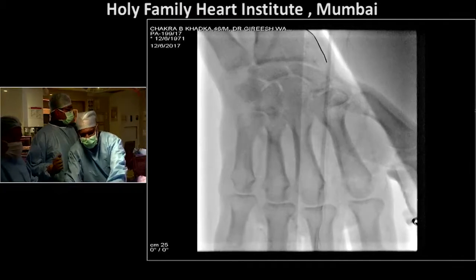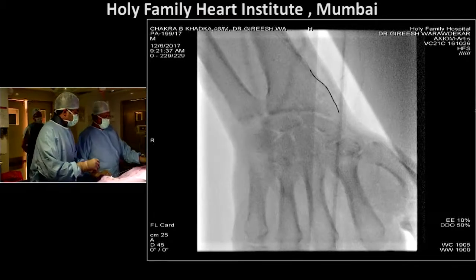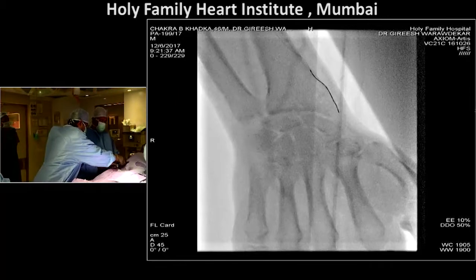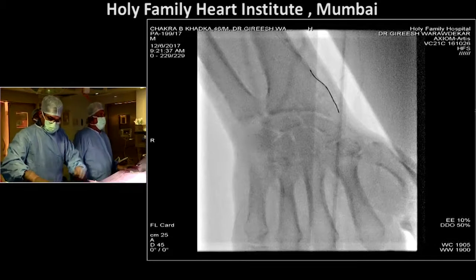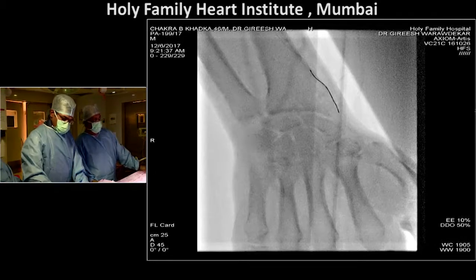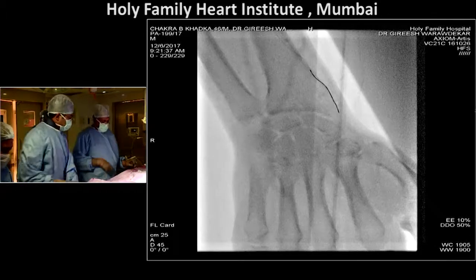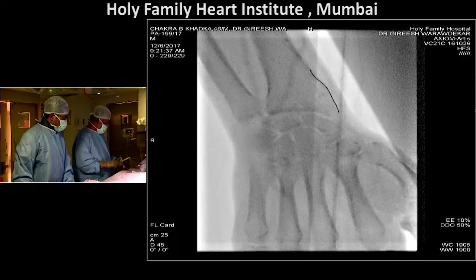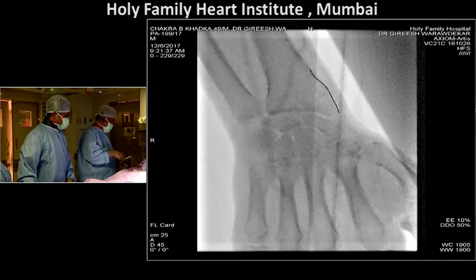No, I have them in the department, but I don't think this is thrombus. So by using a drug-eluting balloon, I don't know how it is going to help in any way. My choice, Girish, is never to use a drug-coated balloon in this. There's a thrombus there, and we know the drug is known to induce more thrombus, and we've burnt our fingers actually, and then we've learned this.